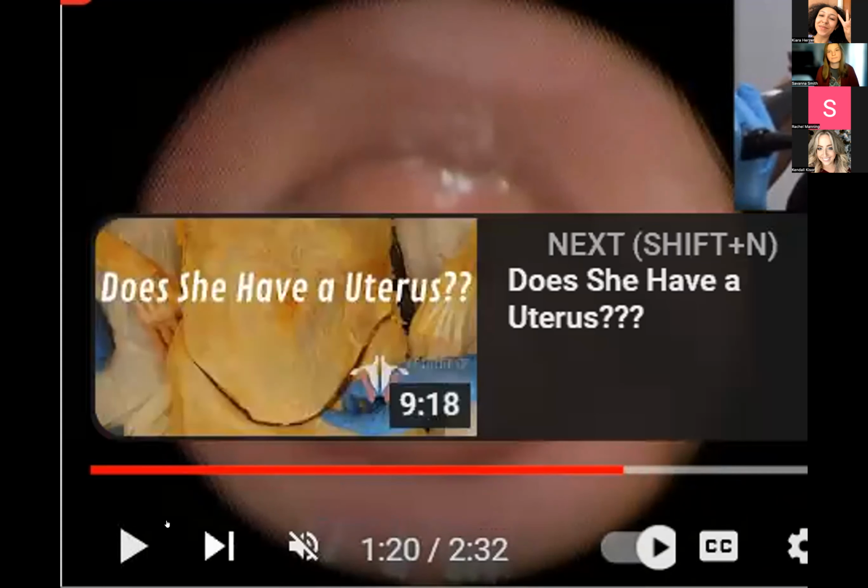And then we also see the vocal folds, the vestibular folds, kind of moving back out to open the trachea because the swallow is done and it's now time for breathing. So we don't see any residue of the leftover milkshake, which indicates this is a normal swallow, and the entire liquid bolus is entering the esophagus as it should. Do we have any questions?